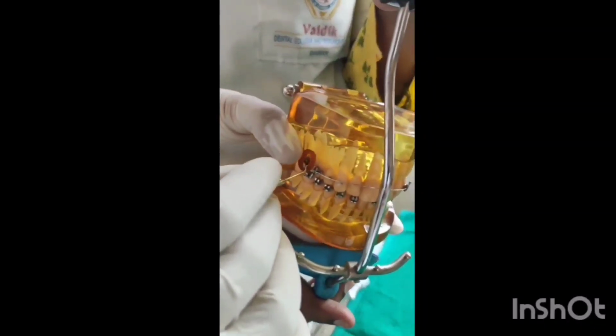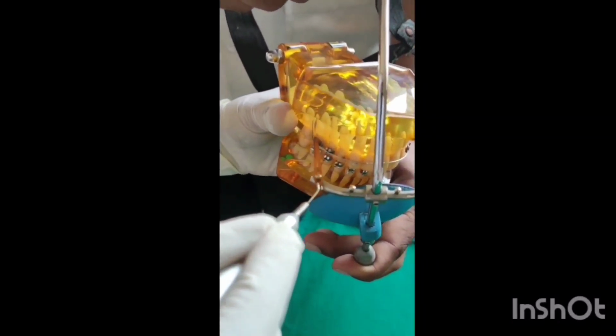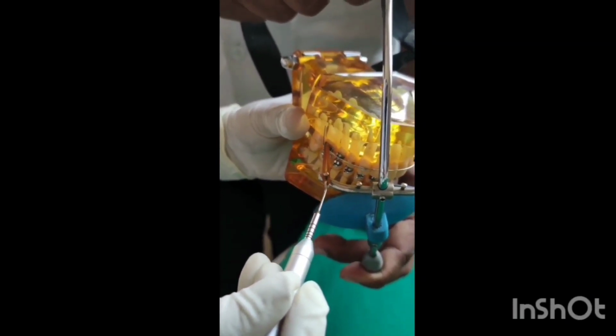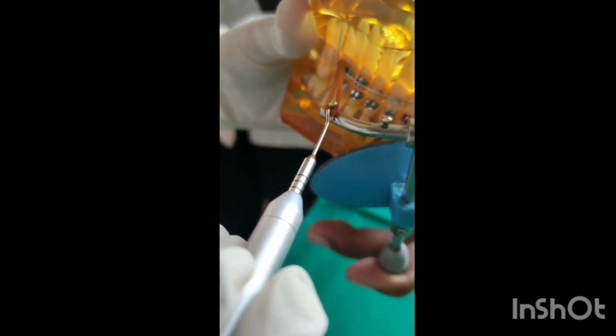Now I will demonstrate how these extraoral elastics engage using the Dontrigs gauge. As we see, first we engage it to the buccal tube of the first molar, that is on the hook of the buccal tube, and then we use the Dontrigs gauge to extend it to the force module, and then we check the amount of force that has been used.